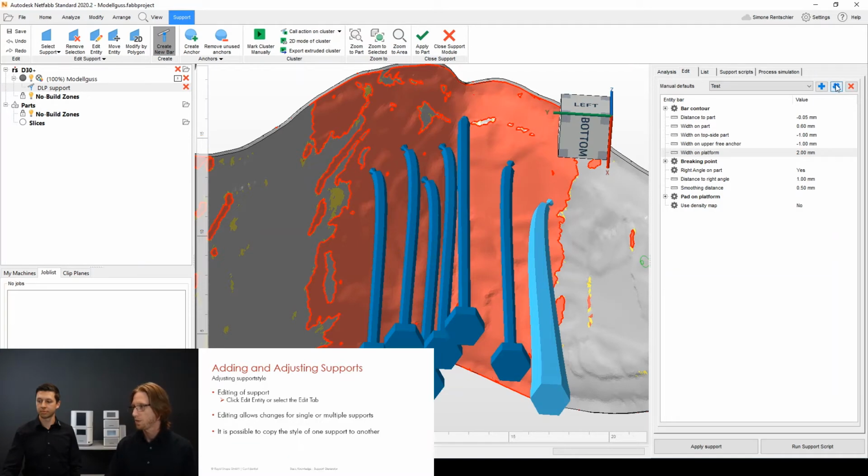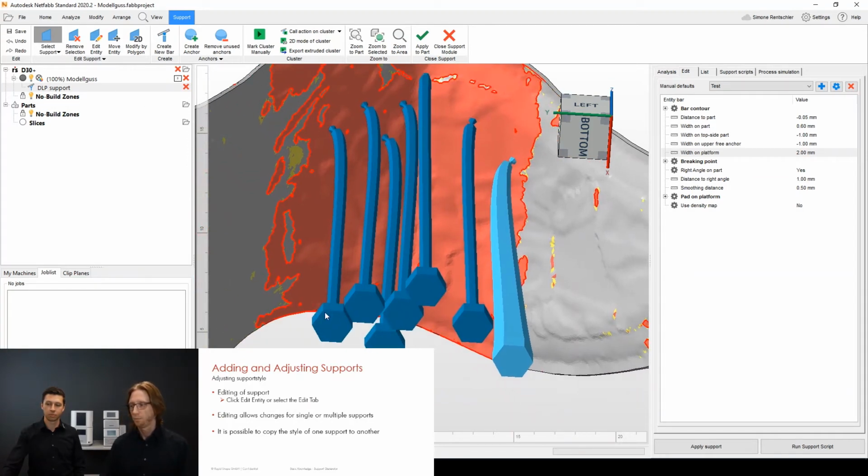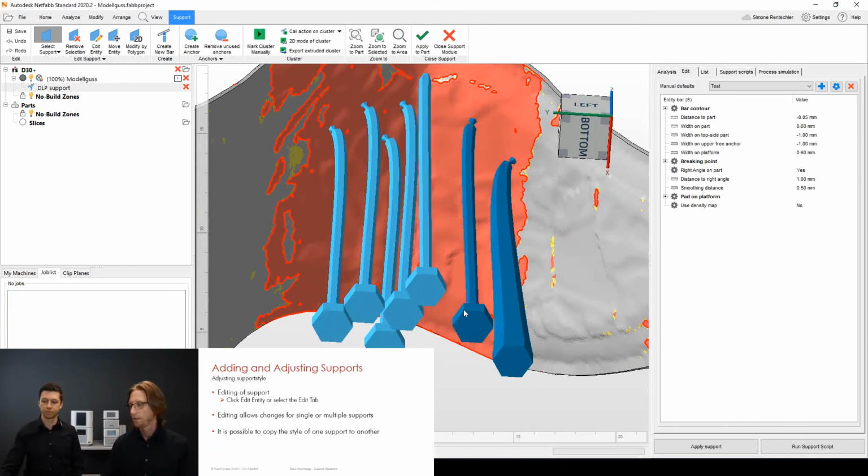So what I do is I just go to the Edit button over there, and then I save selection in this just created test style. And what we can do now is you just highlight all the other supports. Again, we go back to select support. And what you do here is you can either select them manually by just clicking on them and then hold the control button on your keyboard and just selecting all of them.